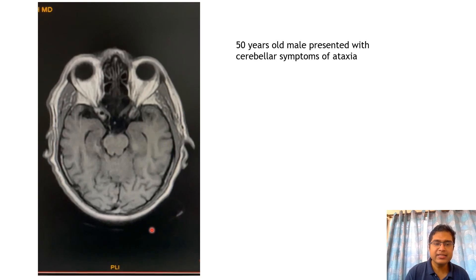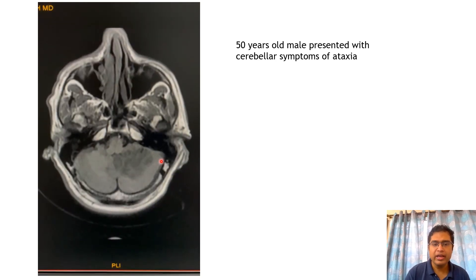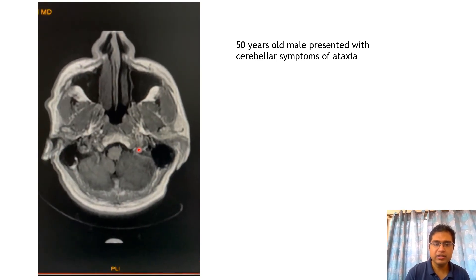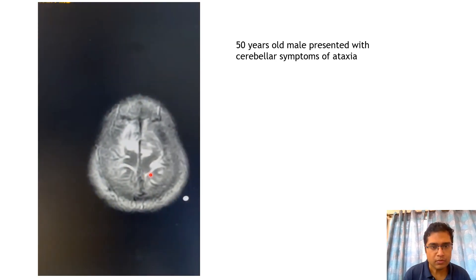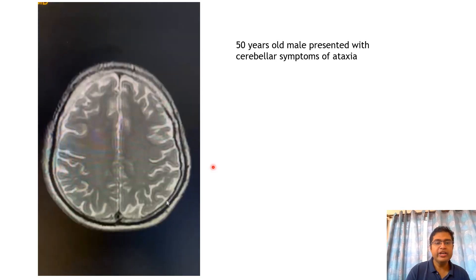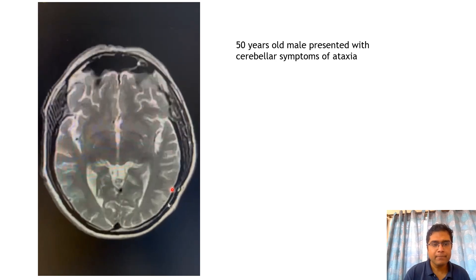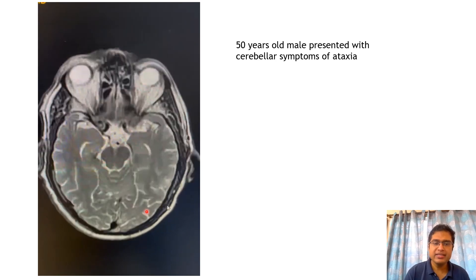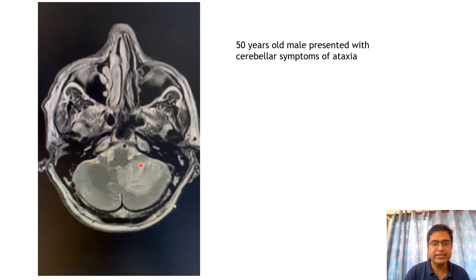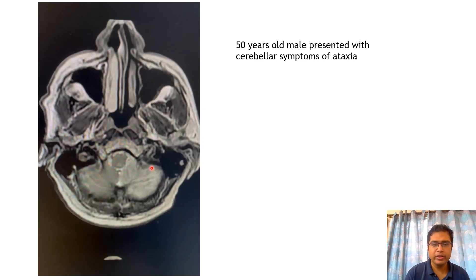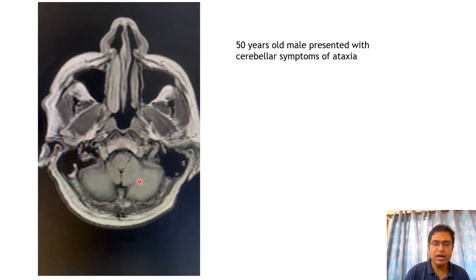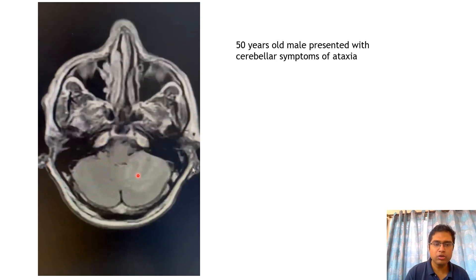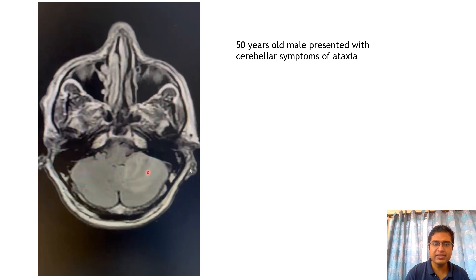On T1-weighted images, we can see a hypointense lesion in the left cerebellar hemisphere extending up to the vermis. On T2-weighted images, there is corresponding hyperintensity seen with prominent cerebellar folia. There is mild mass effect in the form of effacement of the fourth ventricle. On FLAIR images, we can see subtle hyperintensity.